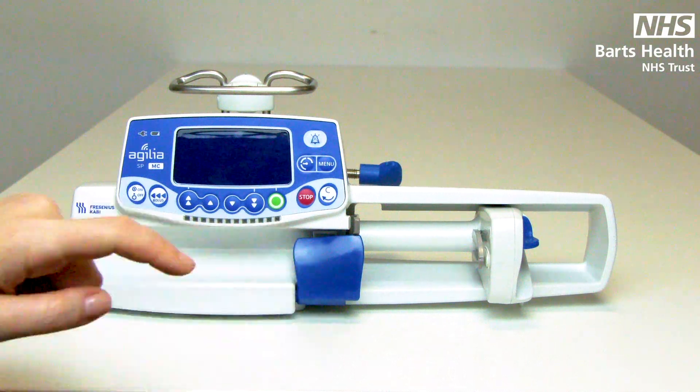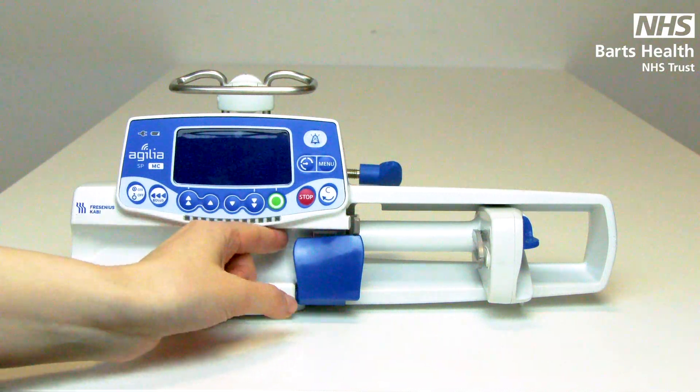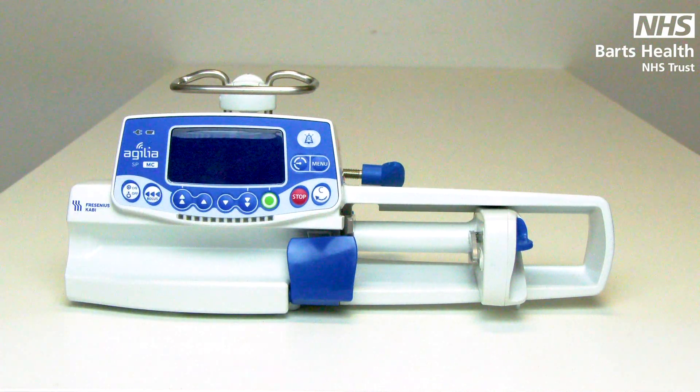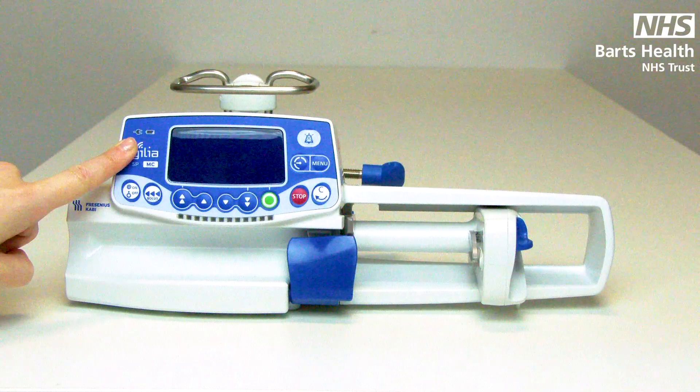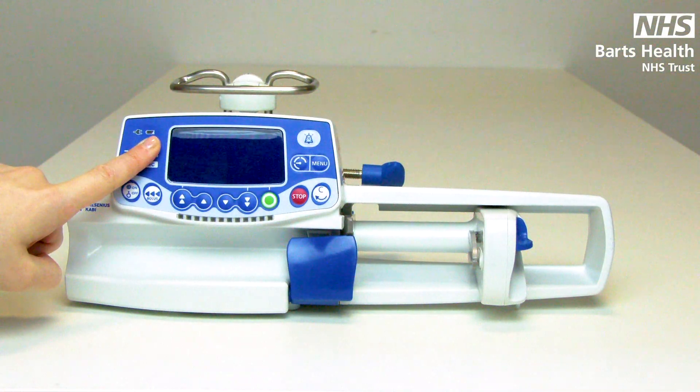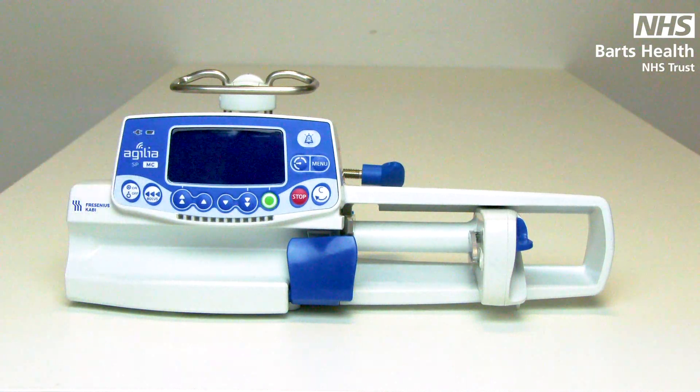Anything blue is a touch point and is moveable. When the device is plugged in, the battery indicator will light green and the battery will flash as it's charging, or remain a solid green light when fully charged. The pump should always be plugged in — this does not damage the battery or the battery life in any way.